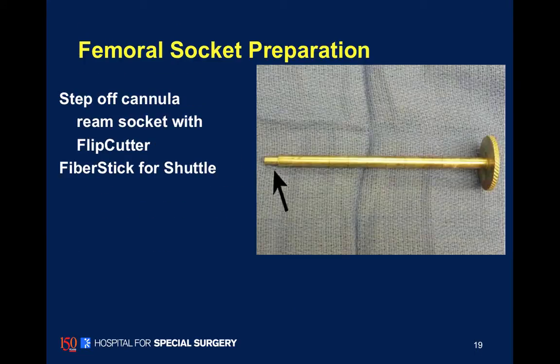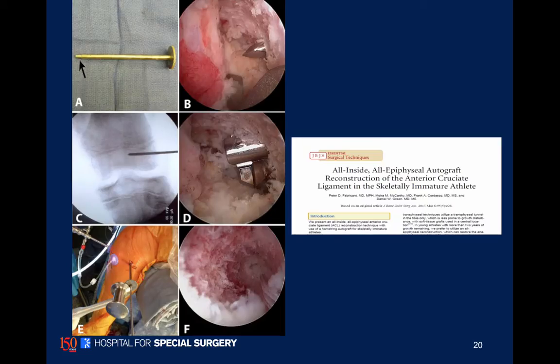This is a unique step guide that we actually hammer through the cortex. When we use this retrograde drill or flip cutter, it hits the metal guide and prevents disruption of the cortex. This is a really helpful tool that allows us to make these sockets.